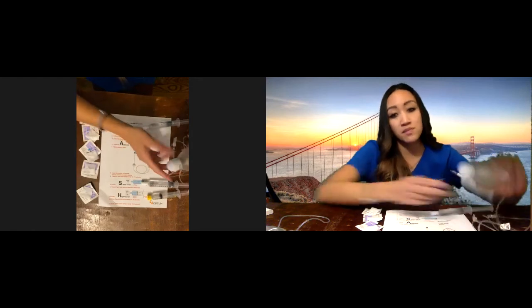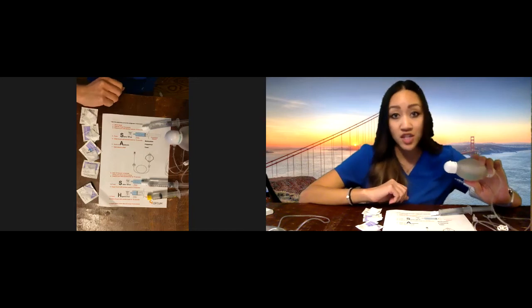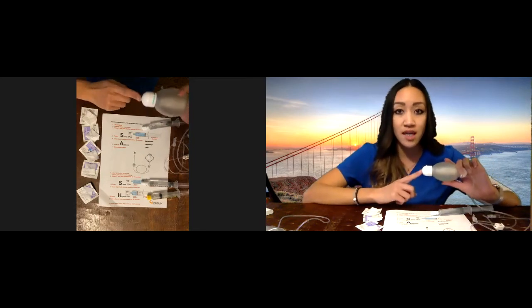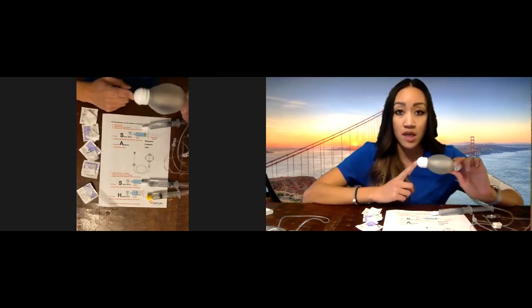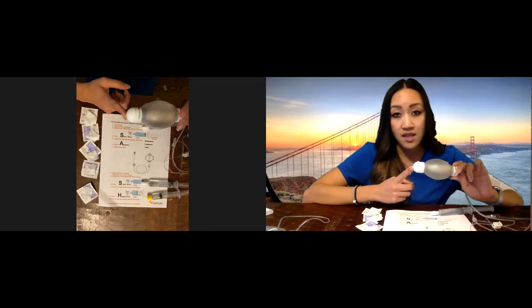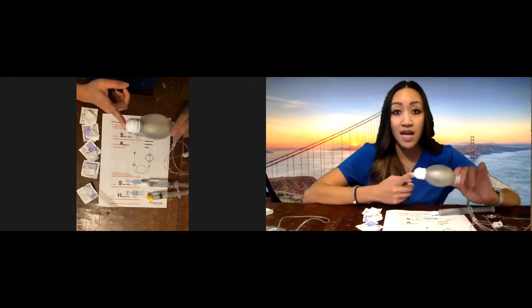The medication ball needs to be kept in the refrigerator. We give you a week supply at a time, so we need to make sure that you keep this in the refrigerator for stability. When it's time to give the medication, take the medication ball out of the refrigerator about two hours before so it's at room temperature. If it's cold, it may run slower and make the patient more chilly. So set an alarm clock to make sure that you take it out at the appropriate time.